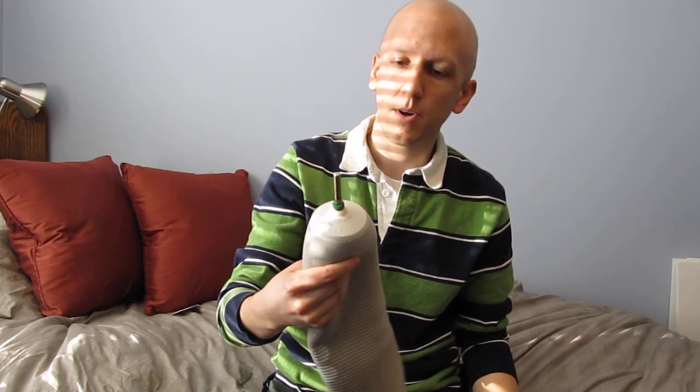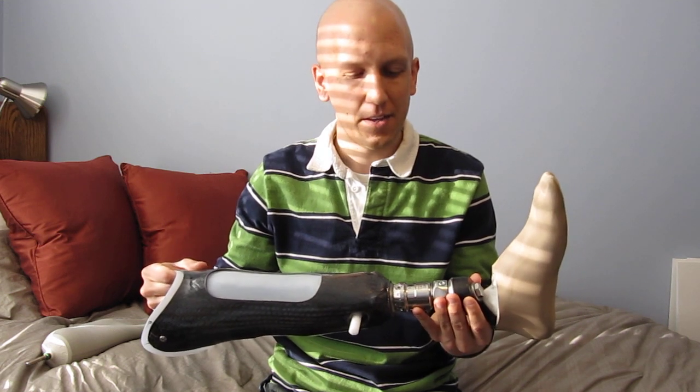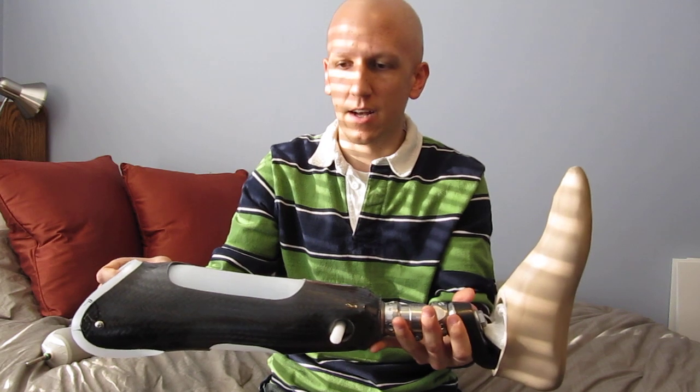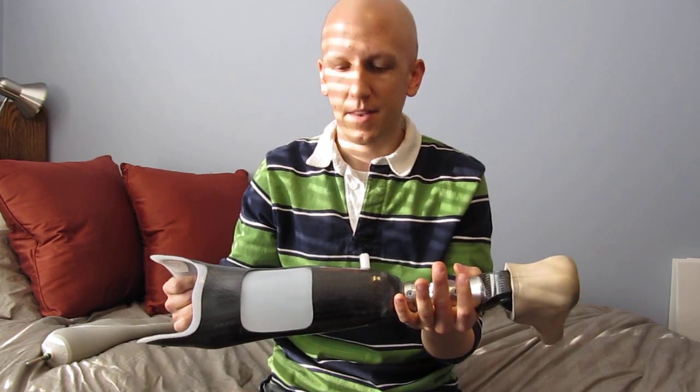Pretty interesting technology. The prosthetist mentioned that it's strong enough to where I could hang from this joint if I wanted to. I don't know how truthful that is and I don't want to try it. But still, it's very secure and very strong. The entire leg is pretty amazing technology and I feel very fortunate that I can have such a nice looking and highly functional leg.